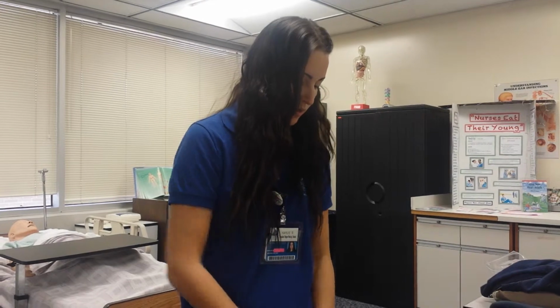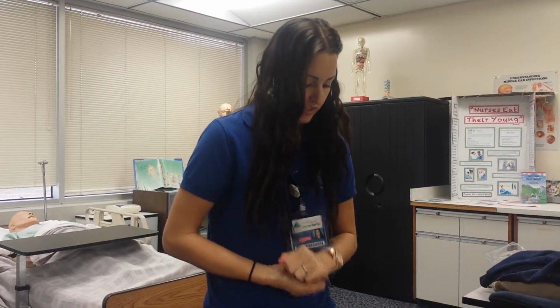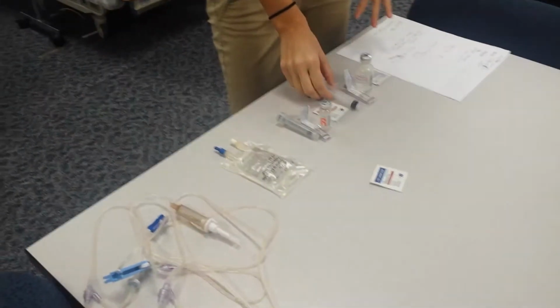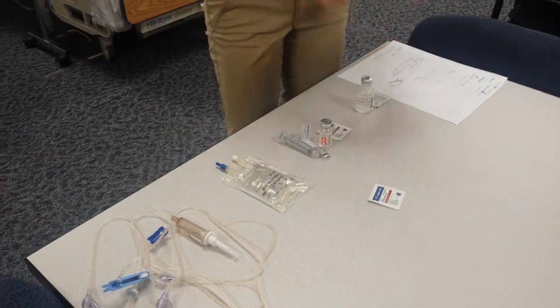Our patient is allergic to aspirin only, so he's safe for the vancomycin. And the lab value that we're looking at is the high white blood cell count, which is why our doctor ordered vancomycin for infection. So what I'm going to do first is draw up 6 milliliters of normal saline as a flush for our line that's already in place.